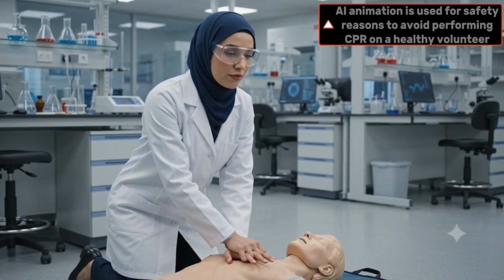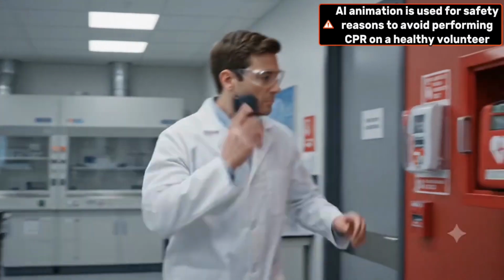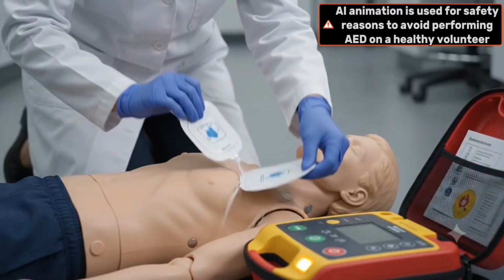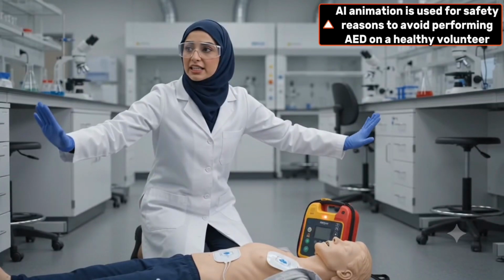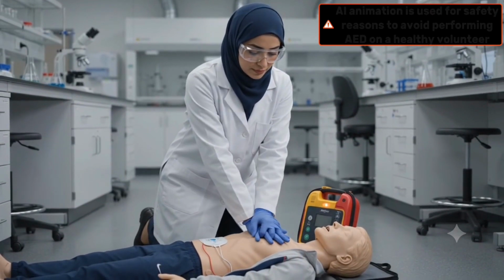Keep a steady rhythm of 30 compressions. You, call 999 and get an AED. I'm calling 999 now. Shock advised. Stand clear. Everyone, stand clear! Do not touch the casualty. Shock delivered. Resume CPR immediately.